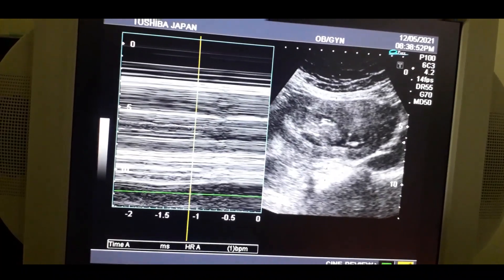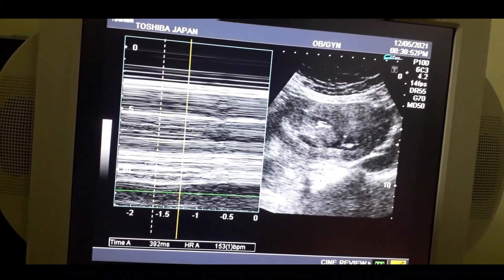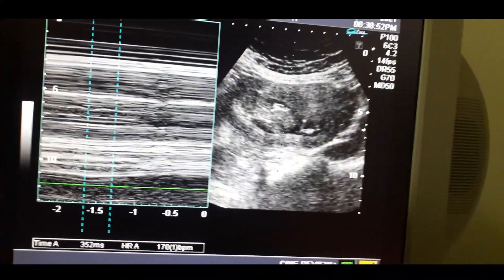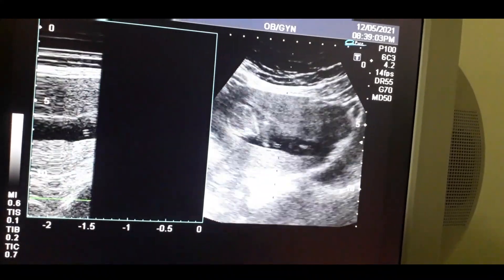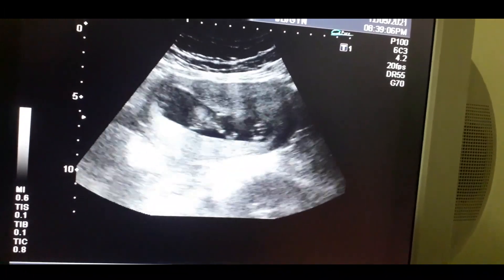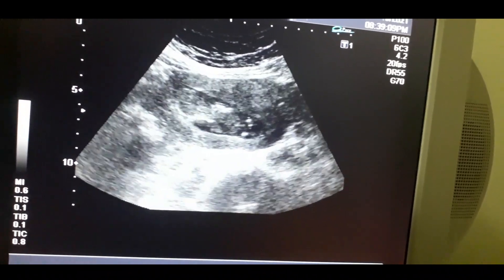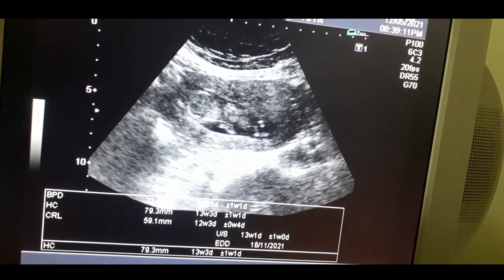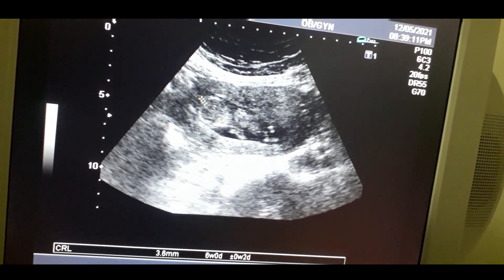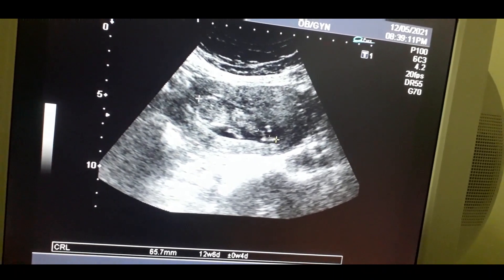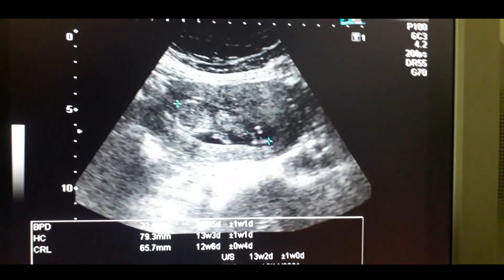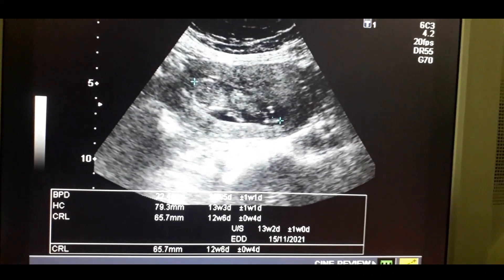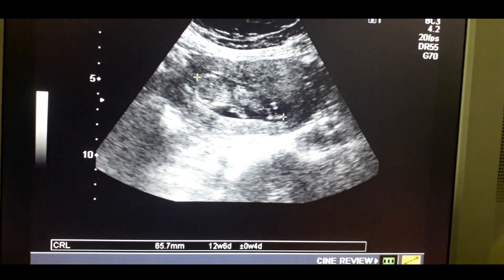At 12 to 13 weeks, there is formation of all major systems in the fetus and organogenesis is complete. I am calculating the CRL — the baby is normal, there is no CNS defect, there is no anomaly, and the gestational age is 12 to 13 weeks.